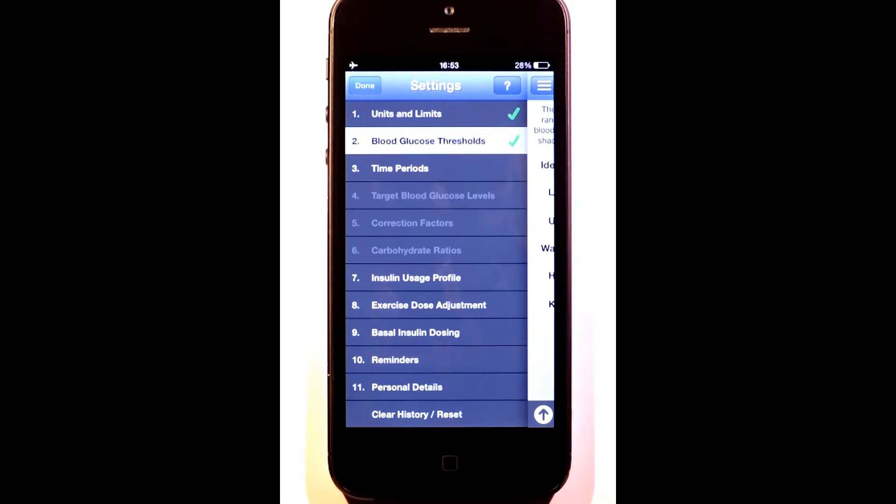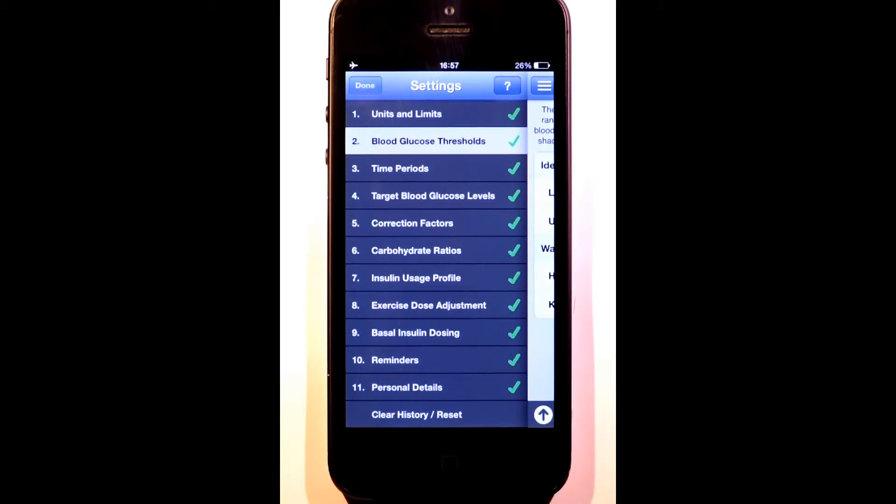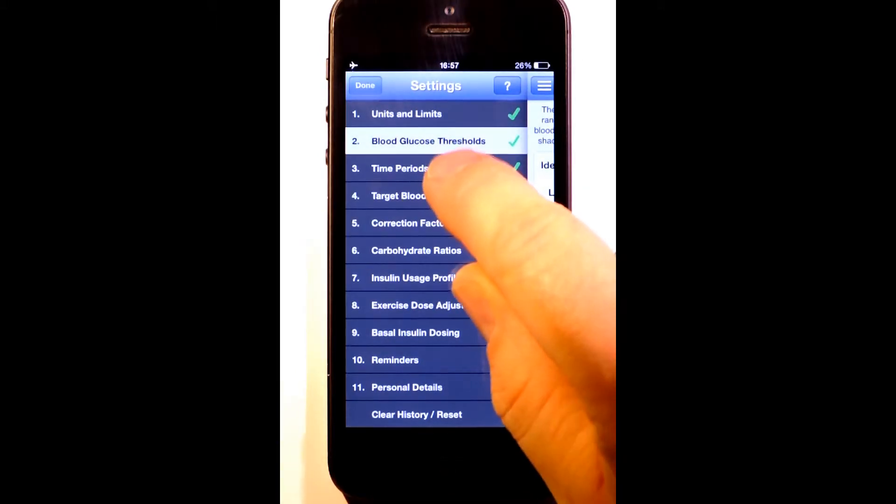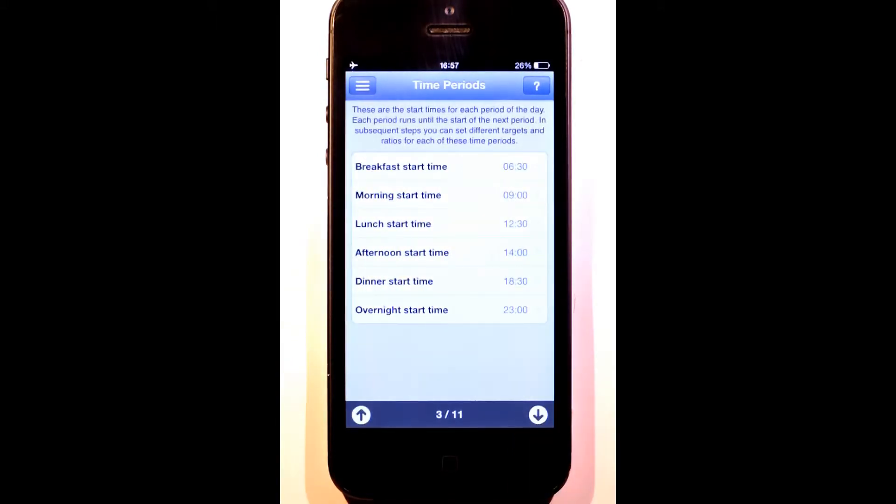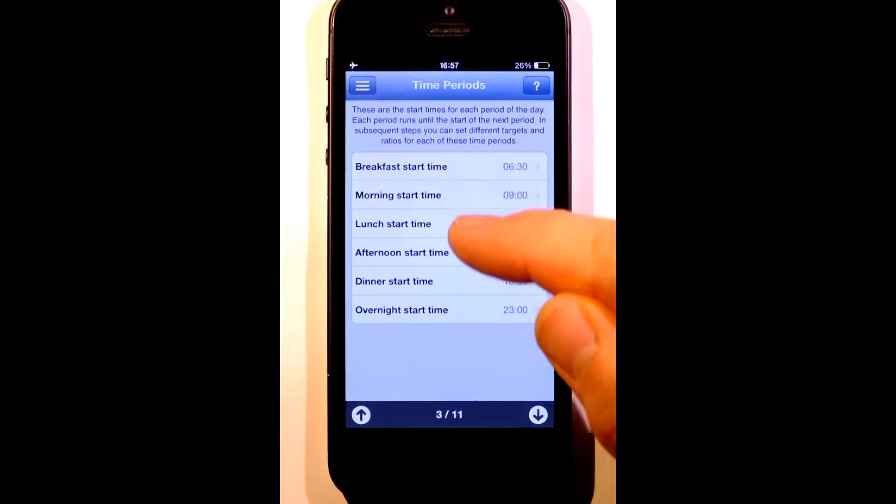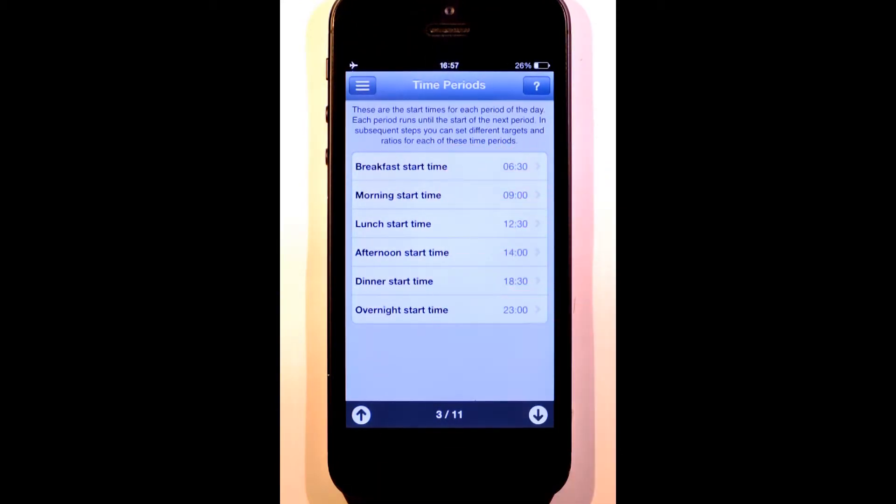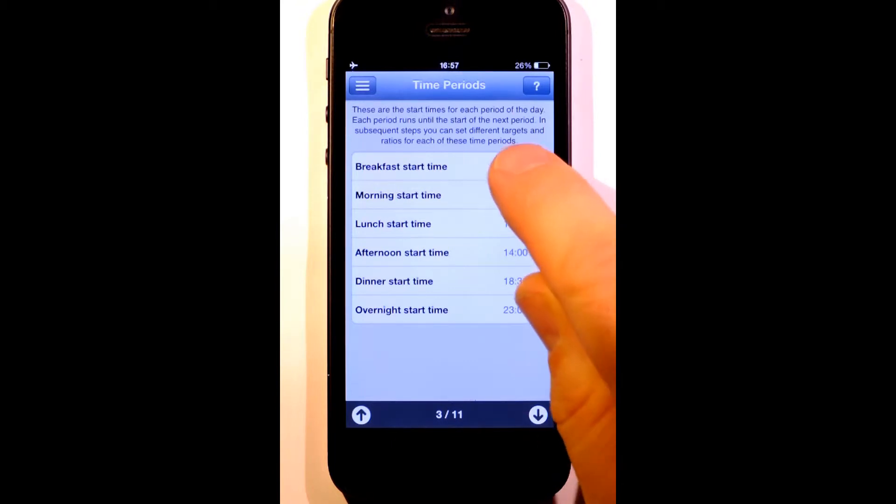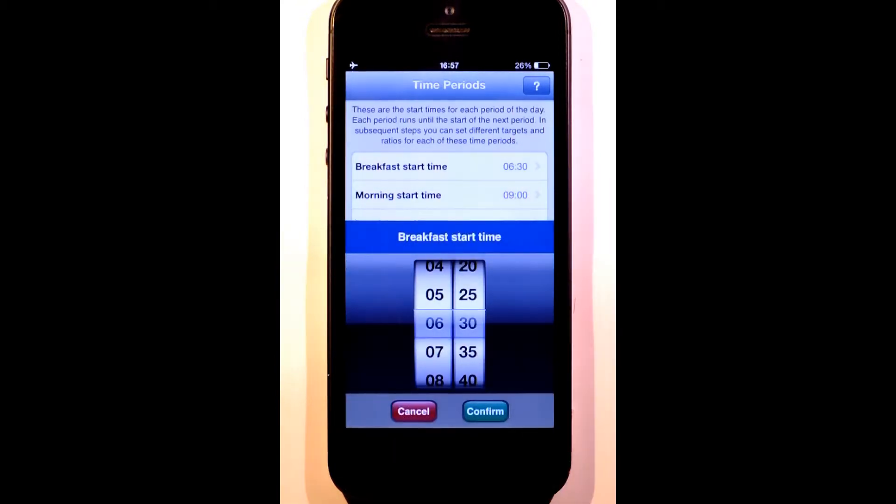To save time, I've filled in the remaining values and will now take you through them. Let's continue to time periods. RapidCalc divides the day into six time periods so that you can have different targets and ratios for different parts of the day. You can customize these time periods by setting the start time for each.